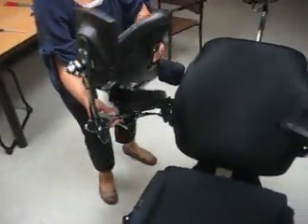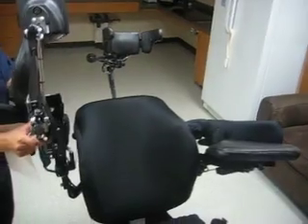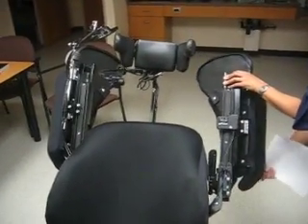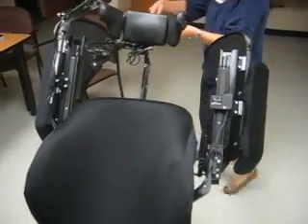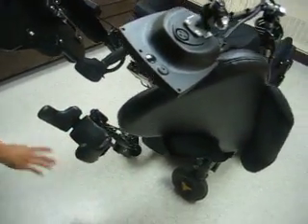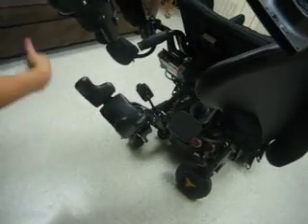Flip the armrest back, being careful to avoid the cheek switch. Release the head controls and snap it back by pulling out on the round knob while keeping a firm hand on the post so that the head array does not fall back. Gently lower the head array and be very careful not to bump or touch the head array when it is in the down position.